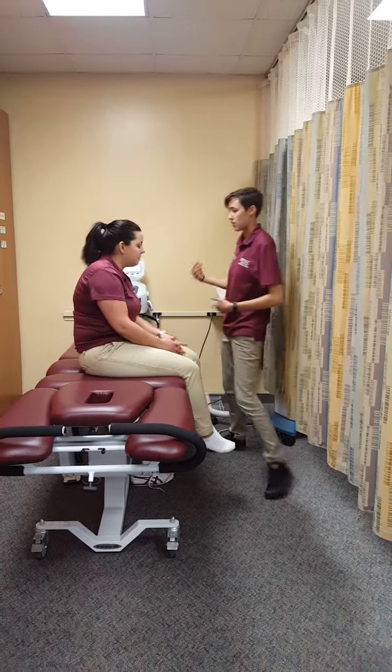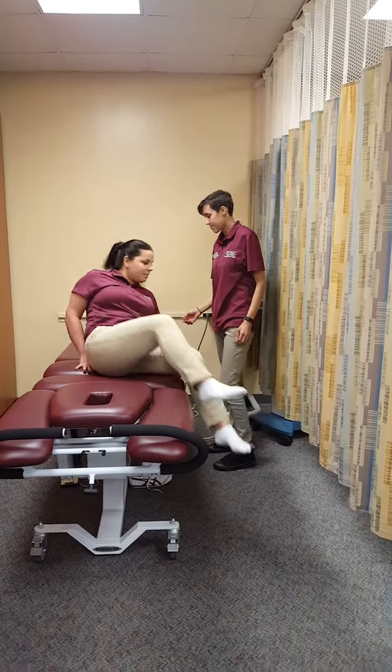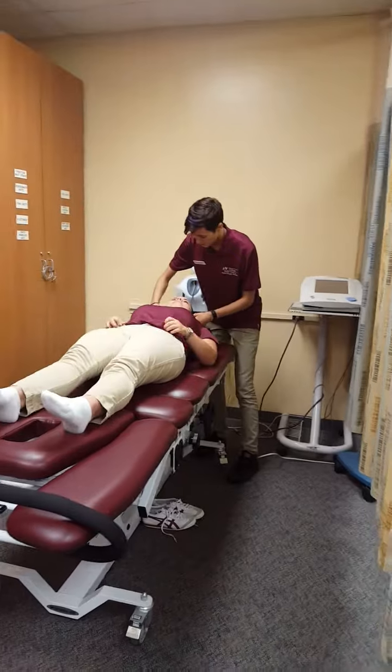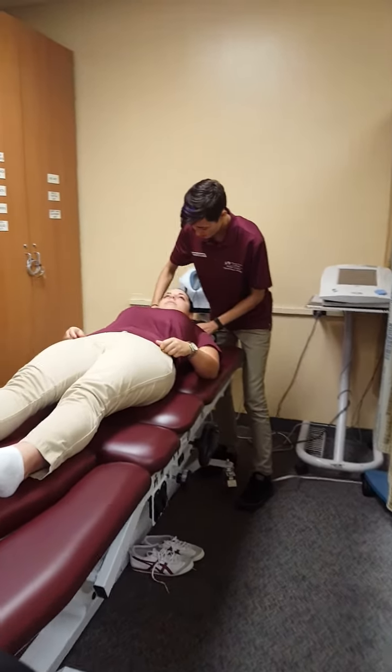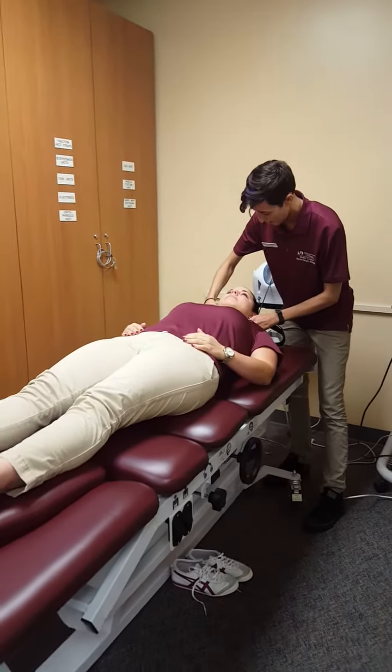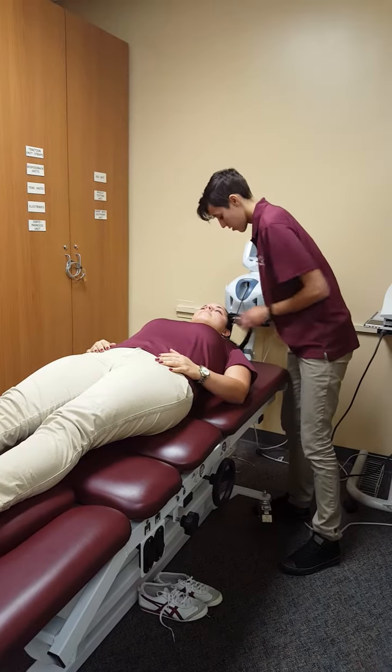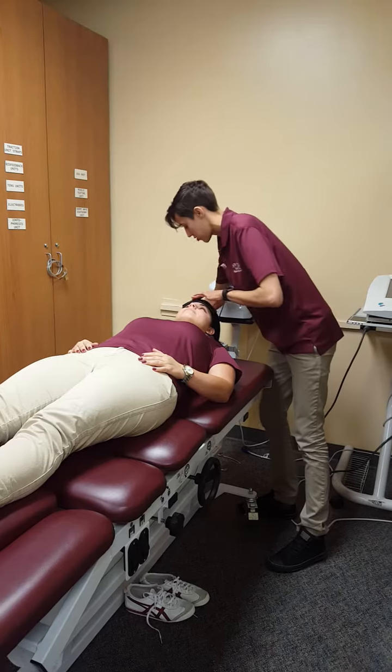If you can just lay down with your head facing up. Awesome. I'm just going to palpate your mastoid process. I'm just going to strap you in — this is just for your safety, just for your protection.